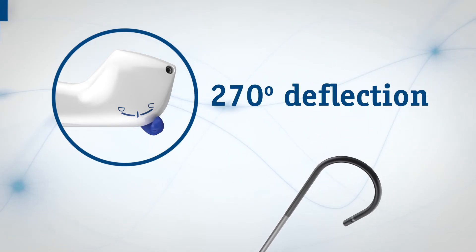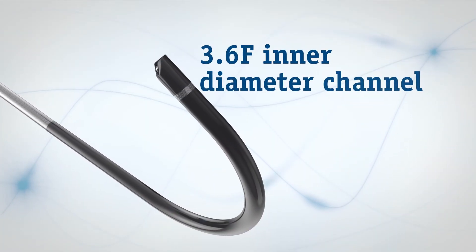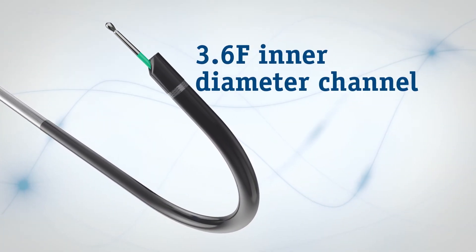The LithoView FlexScope accommodates existing technologies and familiar surgical tools. The lasers, wires, and baskets you rely on today readily pass through the 3.6 French working channel.